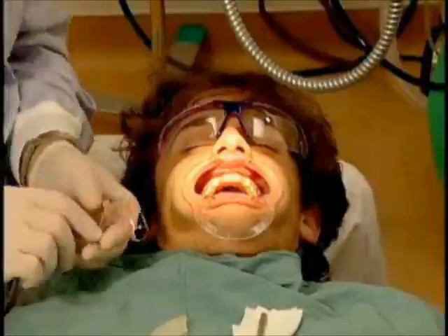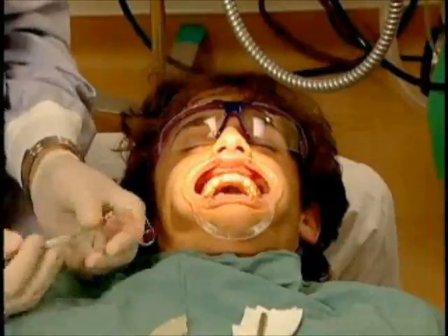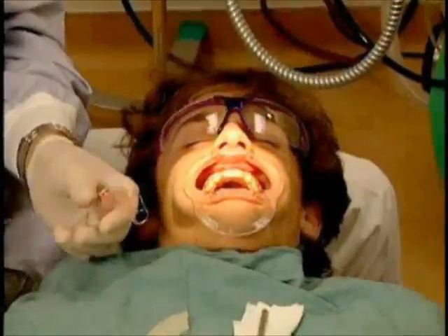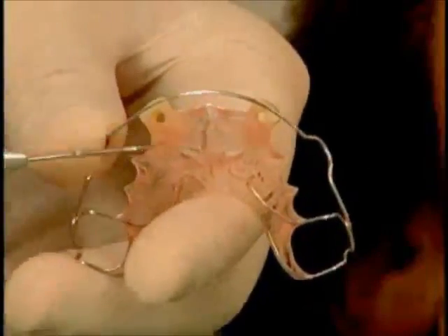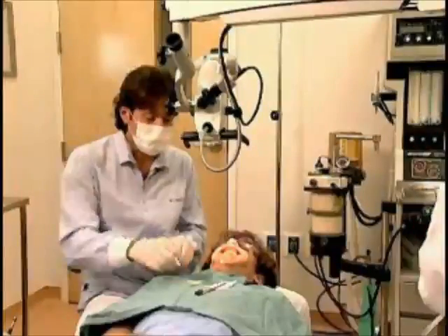We're going to be placing 2 implants, and the 2 implants are going to be placed in the area of congenitally missing lateral incisors. And this is his current stent that he has in place. This is his orthodontic retainer, if you wish, with 2 replacement teeth for his lateral incisors. We're going to be placing the implants basically to coordinate with the future tooth replacement. So this leads to the design of the restorative replacement of his teeth.